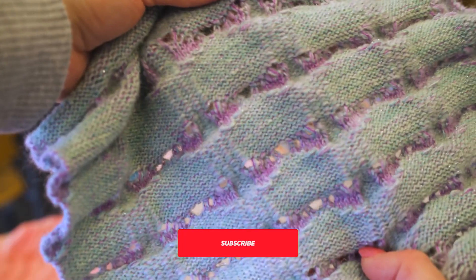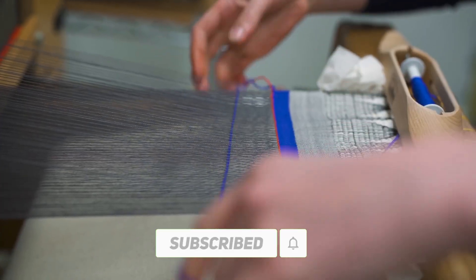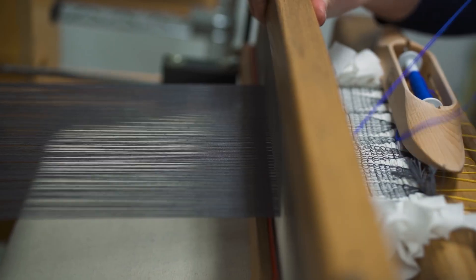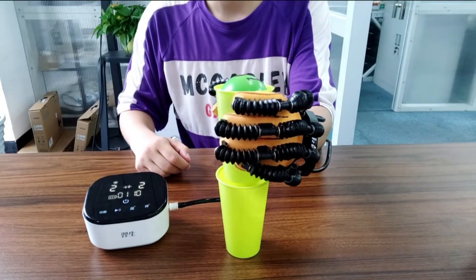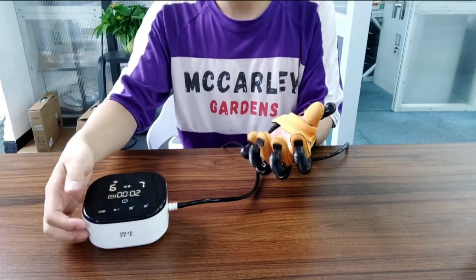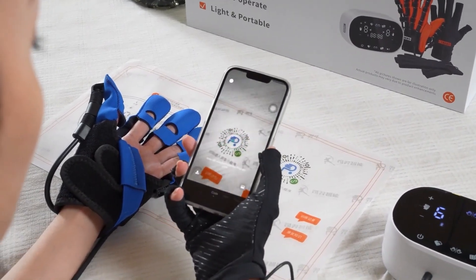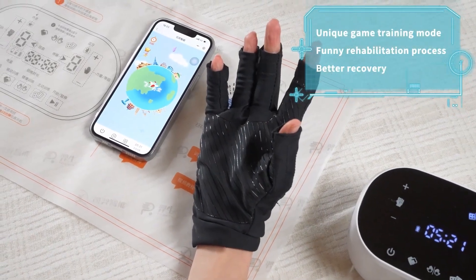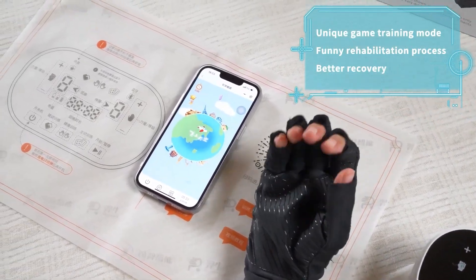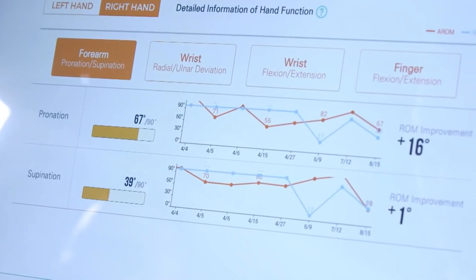The SmartGlove is made of a comfortable and stretchy fabric that incorporates a network of highly sensitive sensor yarns and pressure sensors. These sensors can detect even the smallest stretches and pressures, and accurately determine the angles of all finger joints and the wrist as they move. The sensors then wirelessly transmit the data to a computer or a smartphone, where it can be analyzed and visualized. The SmartGlove can also provide real-time feedback to the patients, such as vibrations, sounds, or lights, to encourage them to perform the exercises correctly and effectively.